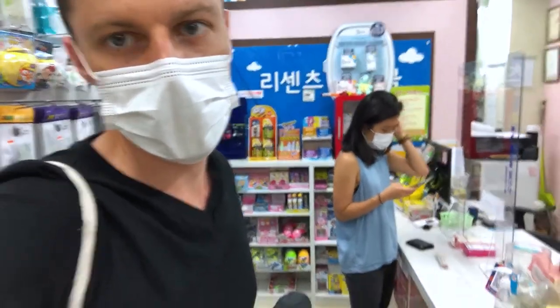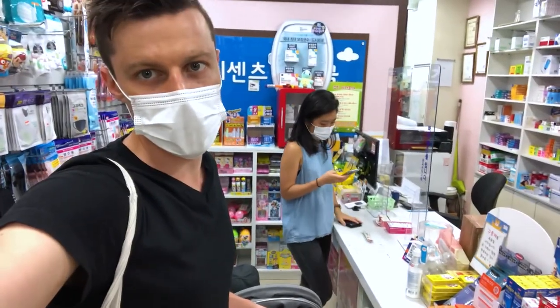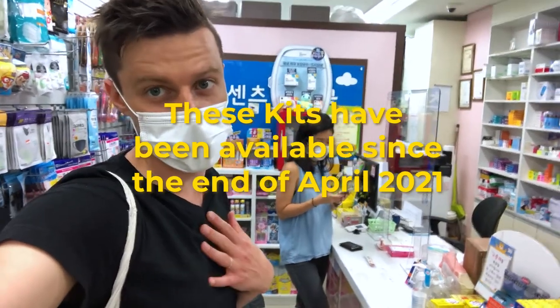So we just saw that here in Korea they have COVID-19 home testing kits, so we're gonna test it out. Let's see.